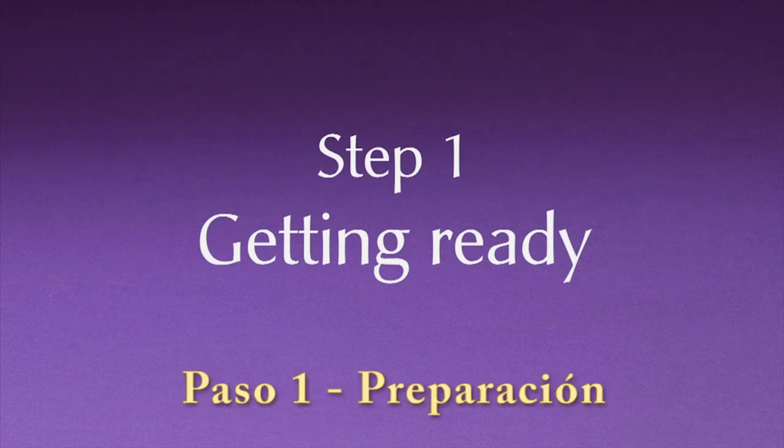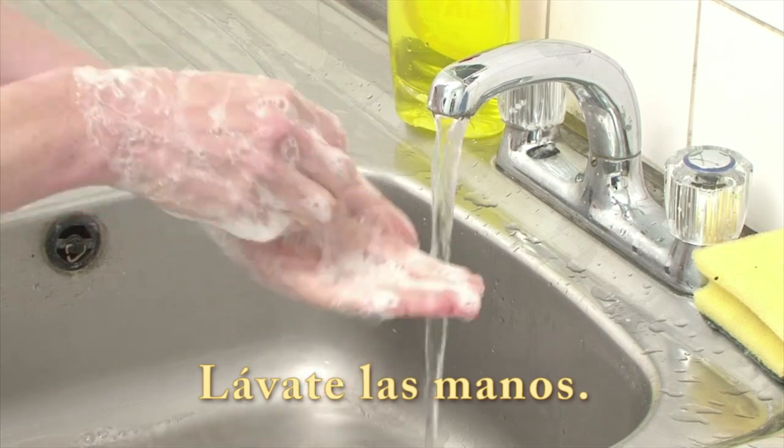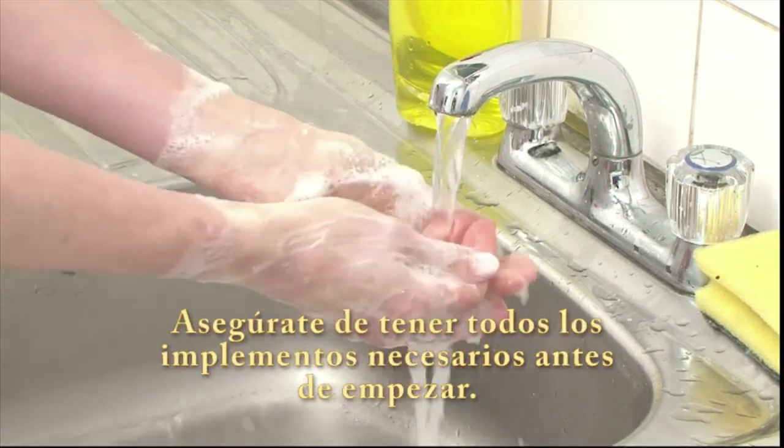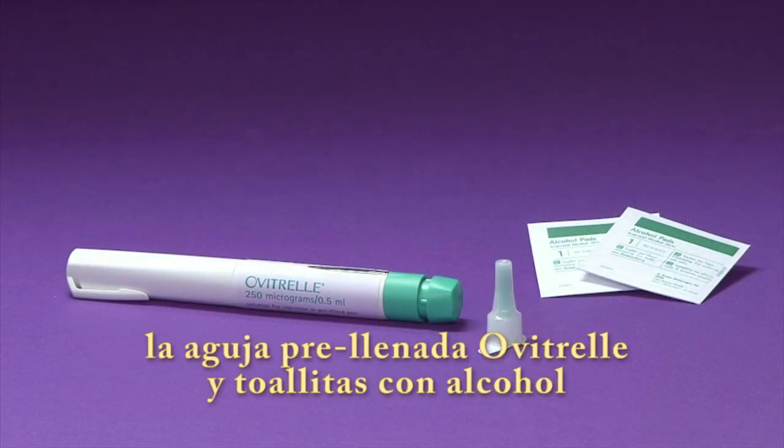Step 1. Getting ready. Wash your hands. Make sure you have all the necessary items before you begin. This should include the Ovitrelle pre-filled pen, 1 needle, and alcohol swabs.